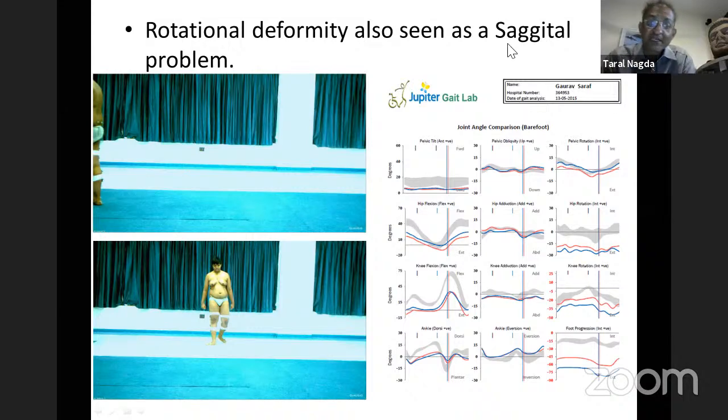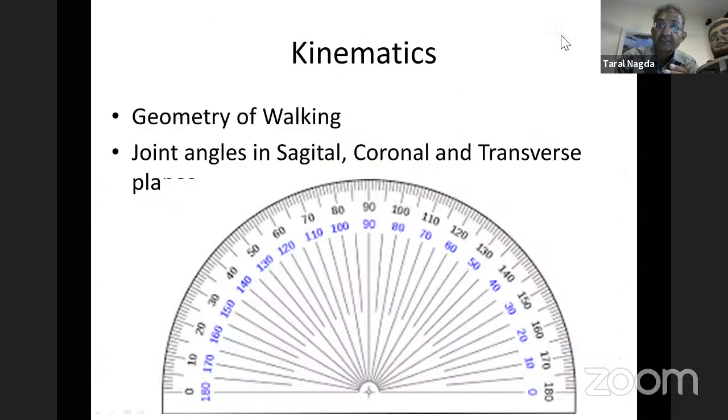It's very important that you don't look at one graph in isolation. Each graph should be valued or interpreted in relation to several other graphs. So 11 other graphs which are there on your chart. At the same time, you have to see all these changes in relation to clinical evaluation and the CT scan. So all clinical findings put together as diagnostic metrics will give you the results. So I hope that I've been able to make it a little simple for all of you.